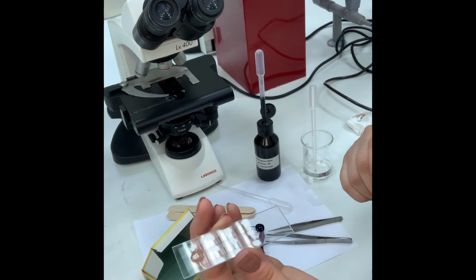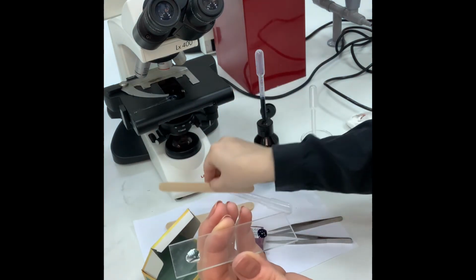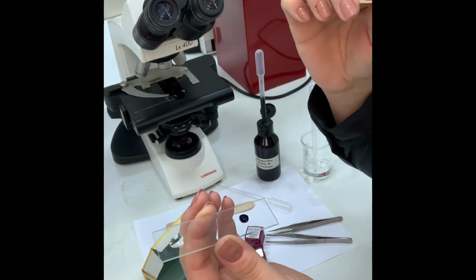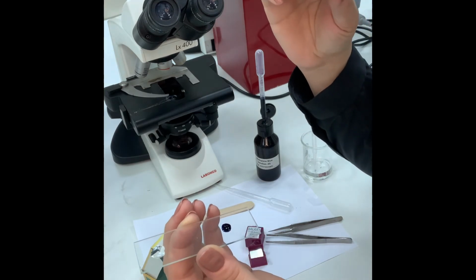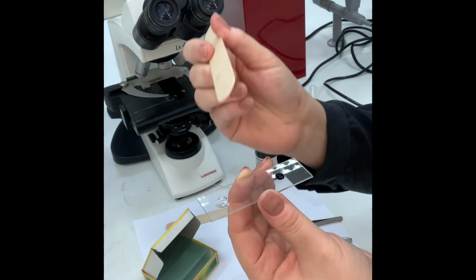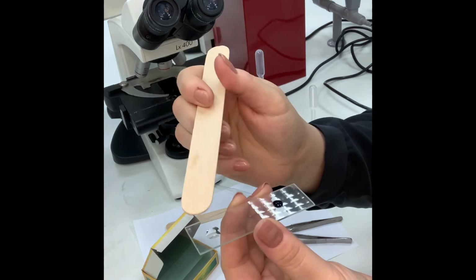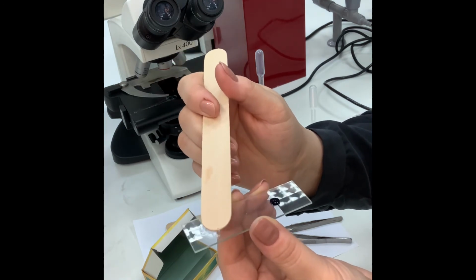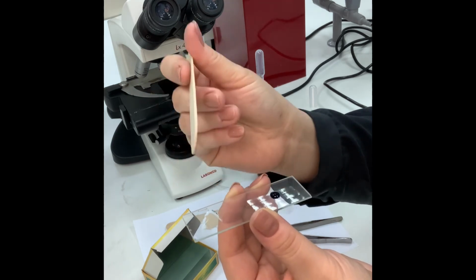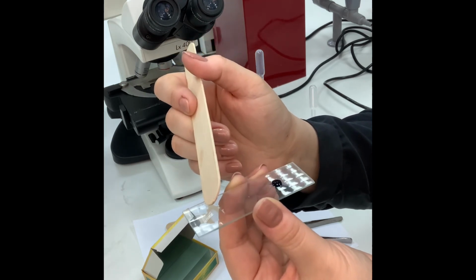So this is a drop of water and this is the drop of stain. Now, how would I collect my cheek cells? I will simply scratch my inner cheek from inside, not the tongue, the inner cheek, okay? And once I'm done, I will apply the sample on the water and give it a little bit of mix. Now, why do I have to mix it? Just to make sure that I'm collecting all the cells from the wooden stick into the drop of water.